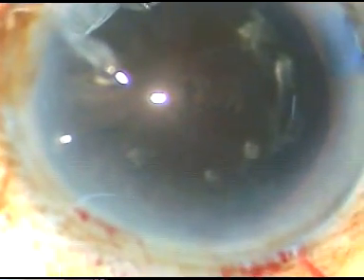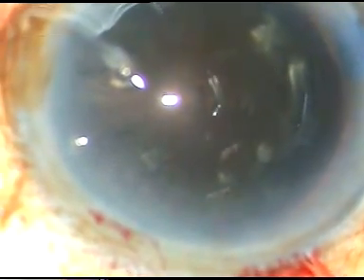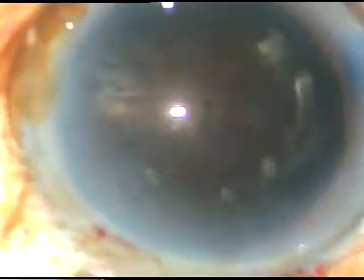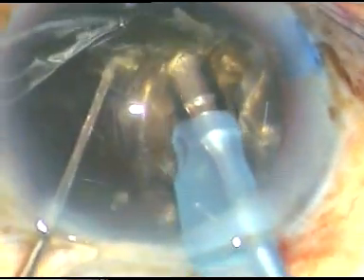And now is the time to enter into the eye to fight with this very hard cataract. The machine being used is the Oertli Cataract 3 phaco machine. This is a very small but very stout machine. I am using almost 95% energy — that is 95% phaco energy. I am in Phaco On mode. Phaco power is 95%. Phaco flow rate is 25 ml per minute. And vacuum is 80 mmHg.